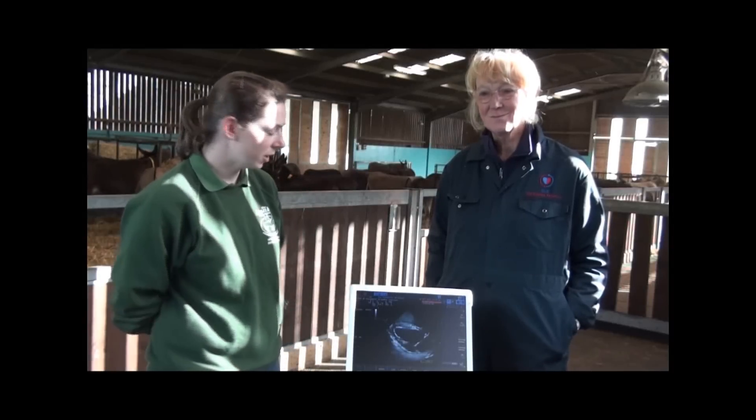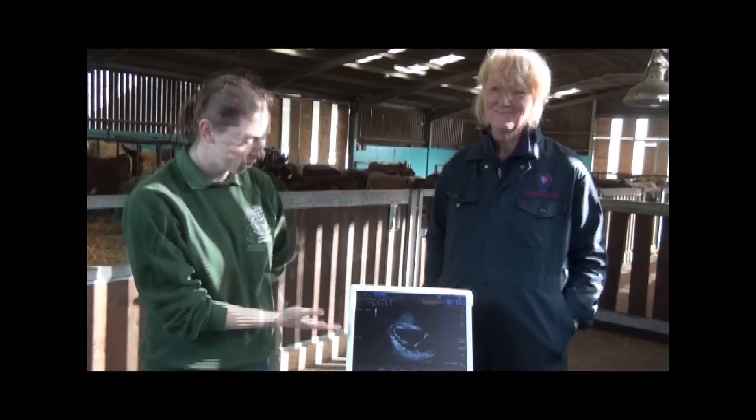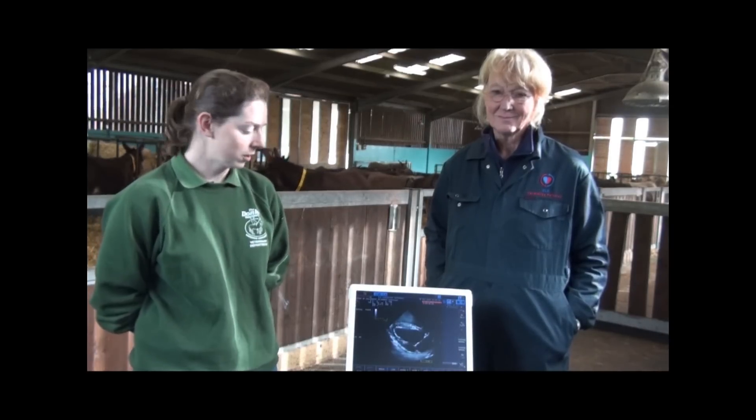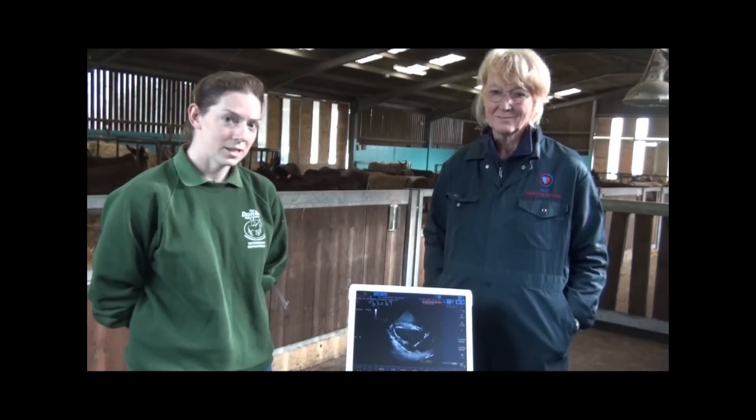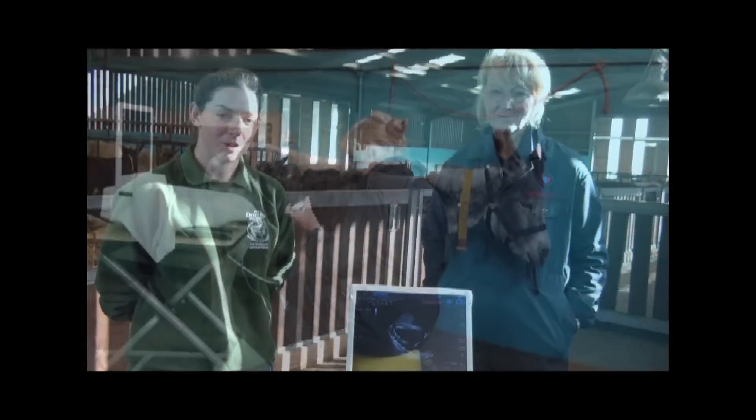We're here today with Sue who is a veterinary cardiologist. She's here to have a look at normal shapes and sizes of donkey hearts so that when we have a sick donkey enter the hospital we know what a normal reference range is, to see if they're altered when the donkeys are sick. It's a non-invasive procedure and the donkeys actually quite like it because they get lots of cuddles, and it's giving us information that will help them in the long run.